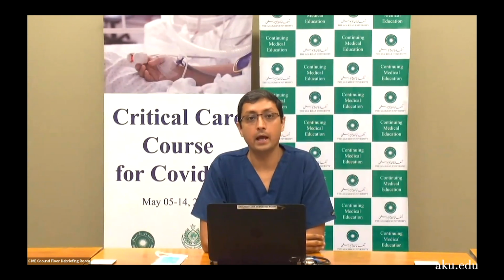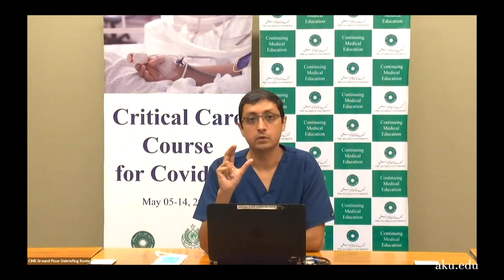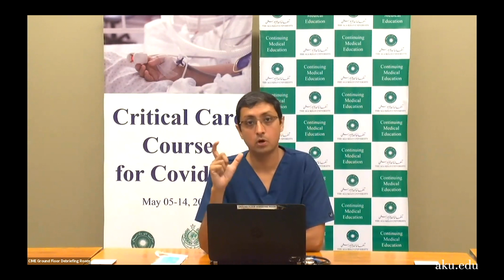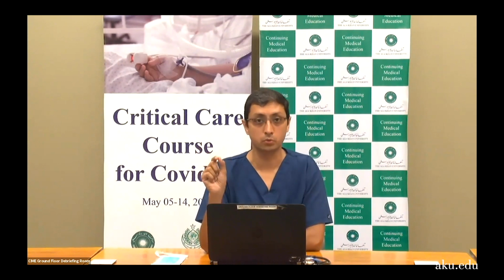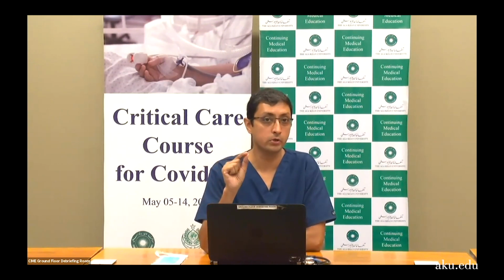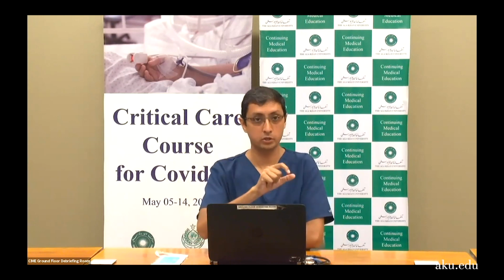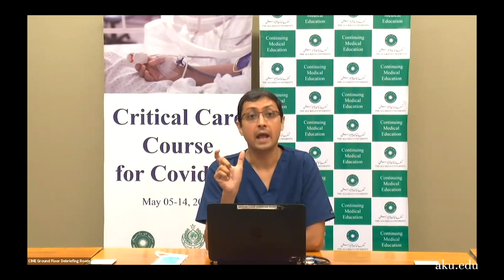Start with anything. And if you don't know, again, this course is just an introduction to ventilation. There is no way that in one talk I or we can make you experts in ventilation. But what to start with, volume or pressure? You look at the alarm limits, you look at the normal limits, you start with an FiO2 of 100%, you secure the airway. You can put a volume or pressure mode. If you put a volume mode, 6 to 8 ml per kg ideal body weight, and if airway pressures are very high, you switch to pressure mode, you change the respiratory rate. You look at the minute ventilation that you want to measure and you focus on that and you call for help.